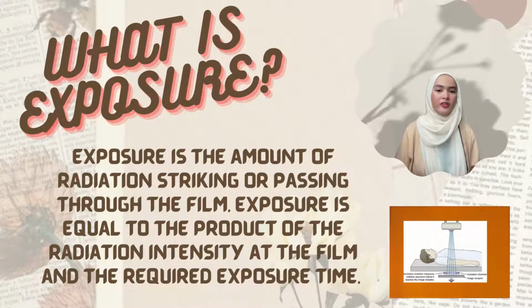Exposure is the amount of radiation striking or passing through the film. Exposure is equal to the product of the radiation intensity at the film and the required exposure time. Radiation exposure can be accumulated over the time of exposure.